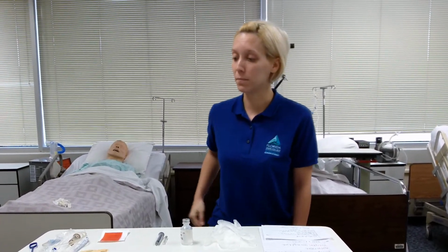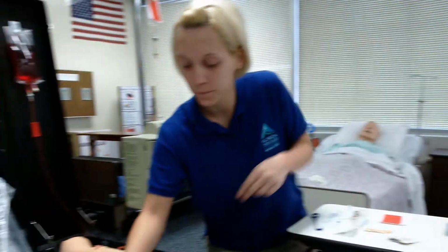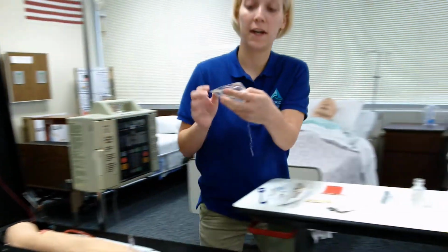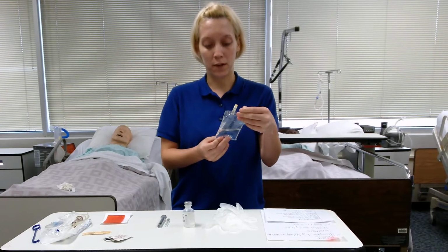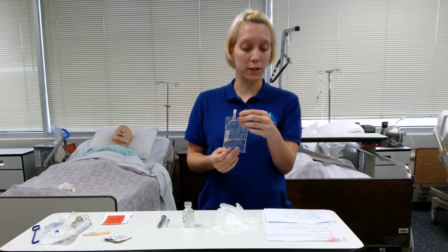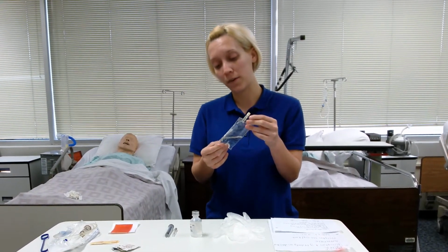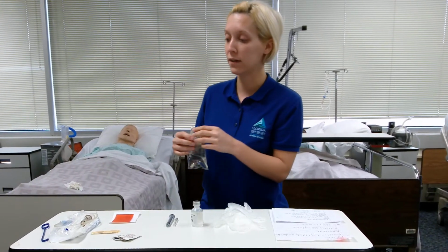And basically my bag that I have here is 50 mLs. So I know we're going to be infusing it over 30 minutes. So it would be 50 divided by 30, and the drop factor on here is 10. So that would give me 17 drops per minute.